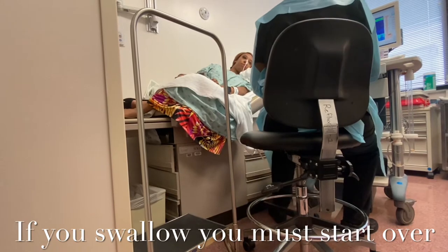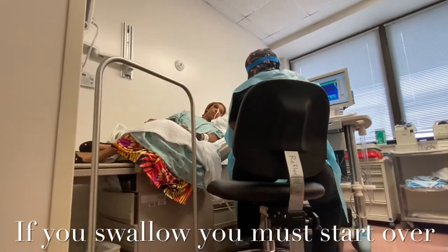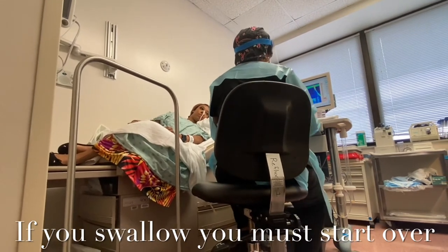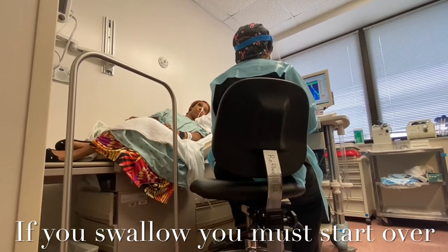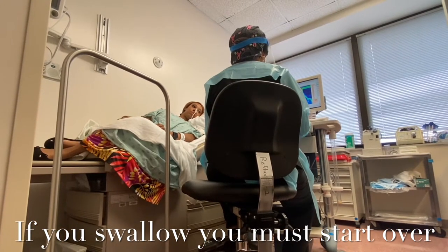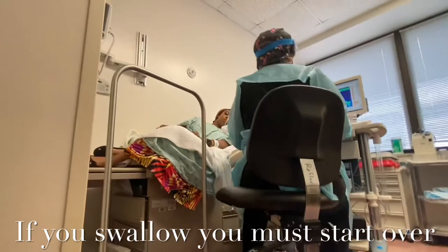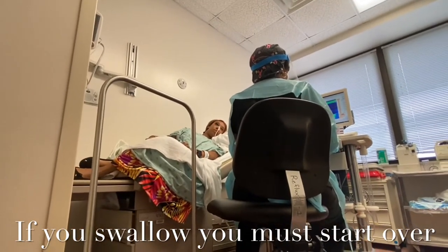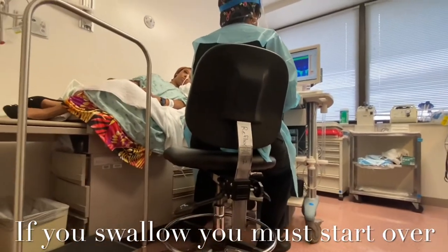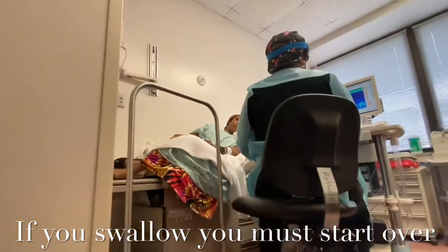Please don't swallow, don't clear, for 30 seconds. And then you can swallow and clear. You're doing great. Okay, a little extra swallow. Relax those shoulders. Perfect level here. Swallow, please, hang on.